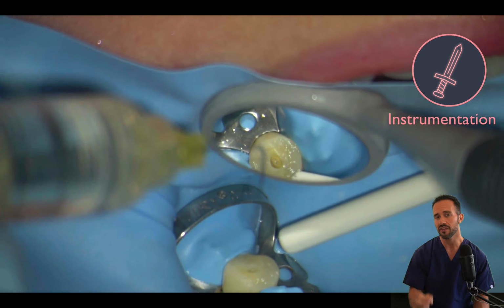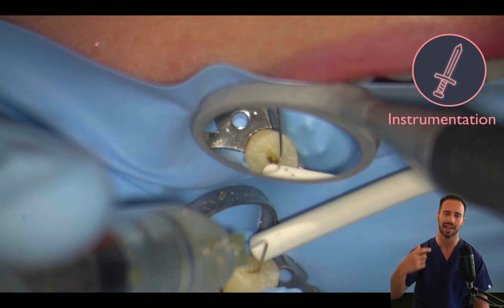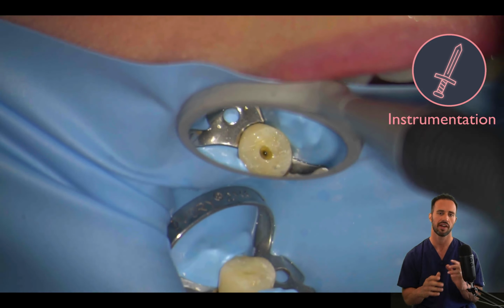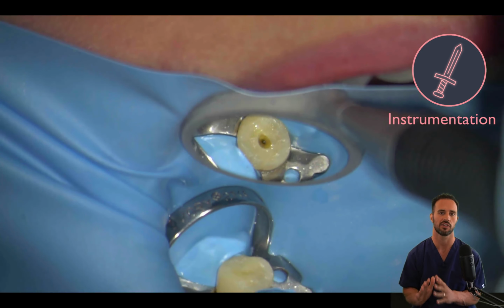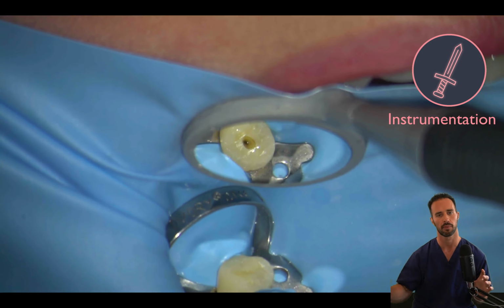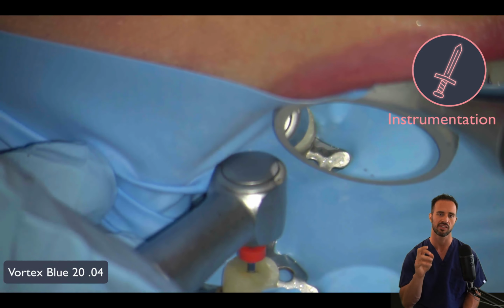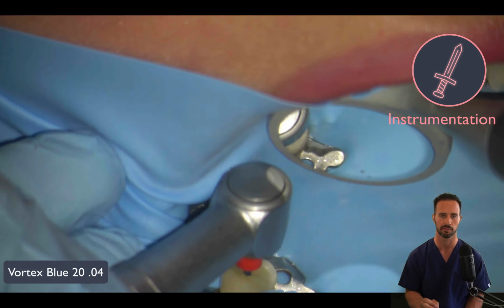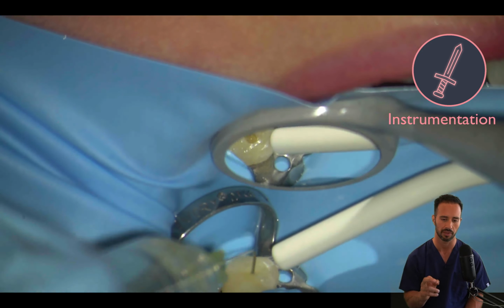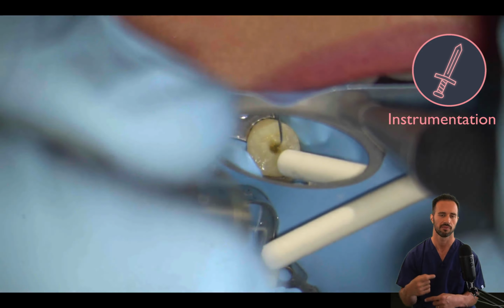And remember, between every single rotary file, we want to use a lot of sodium hypochlorite, again in a 50-50 dilution, to try to minimize any chances of a sodium hypochlorite accident, which I'll discuss in the postoperative complications section. So now we're moving on to our size 20 04 Vortex Blue rotary file, and taking that all the way to 23 millimeters, and again rinsing with our sodium hypochlorite between the files.